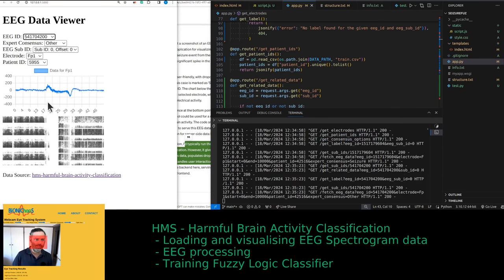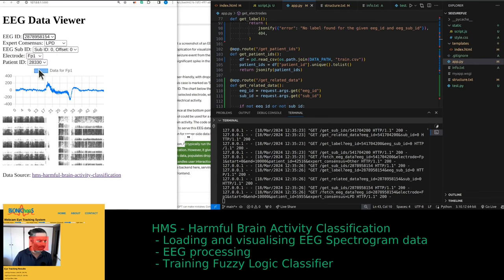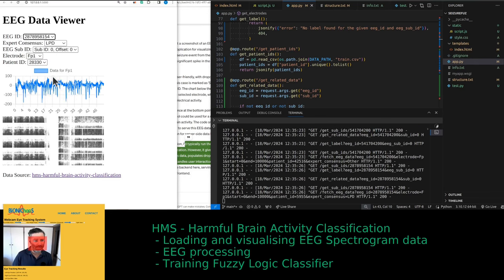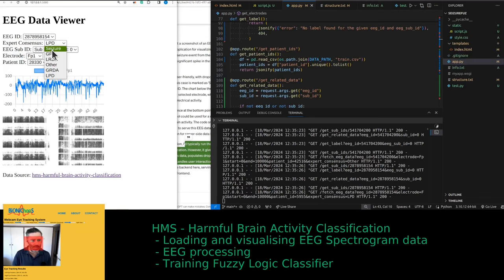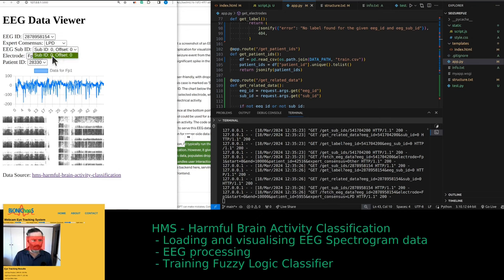We have the EEG ID and different types of EEG — it looks like potentially spiking, with LPD being one of the labels. We have six labels total, with experts labeling this data.